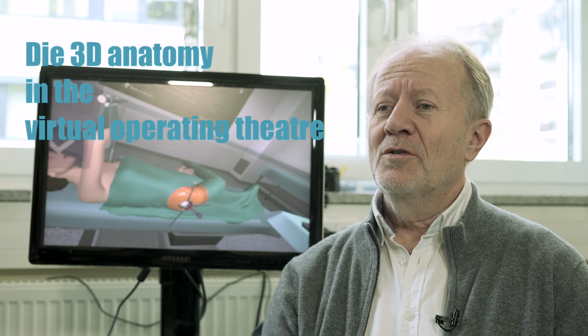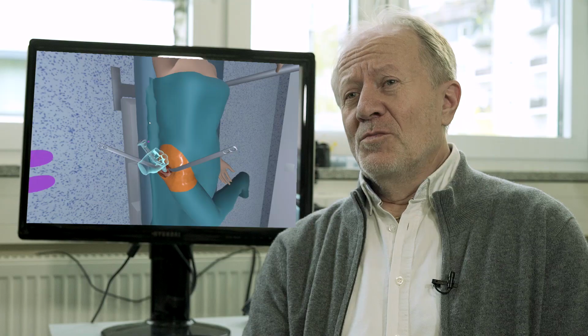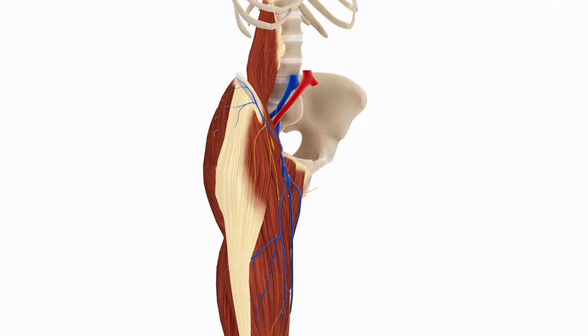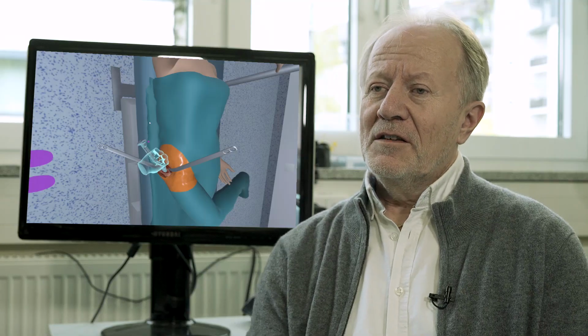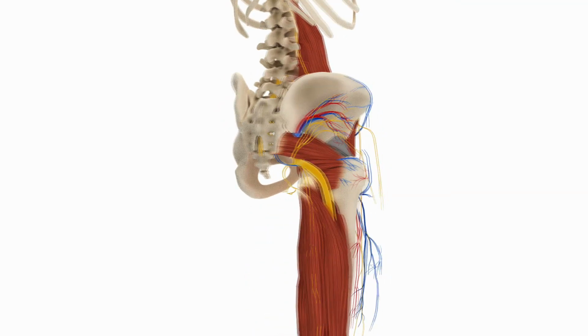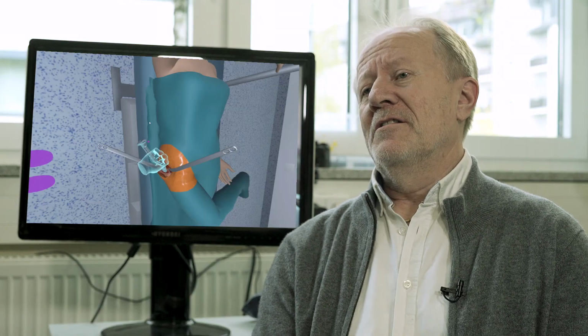We prepared the 3D objects to allow for this. First of all, you need an anatomy that works for real-time systems. For this, of course, the skeleton and the muscles all have to be taken into account. And the muscles have to be pulled apart, and that's why they don't lie as they would in a standard anatomy. And therefore the tissue above them, i.e. the fat layer and the skin, the vessels, the nerve pathways, the lymphatic pathways, all has to be taken into account as well.